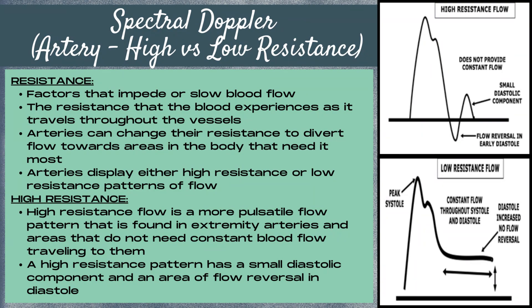So how do you tell the difference between a high resistance pattern and a low resistance pattern on spectral Doppler? Look at the waveform and find diastole. If there's little to no diastolic flow present, the pattern is a high resistance waveform. If there's a high amount of diastolic flow, the waveform is low resistance.